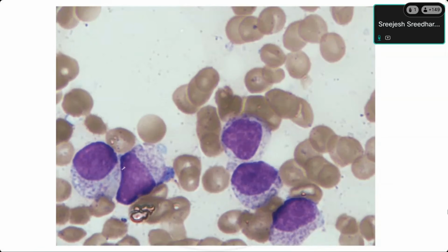Suppose this patient is presenting with fever, some cytopenias, and large lymphocytes. Large granular lymphocytes usually will not have so much granules. Okay, you can confuse it, but when you see under a microscope, it is very unlikely. They are usually smaller and the granules are not this coarse.